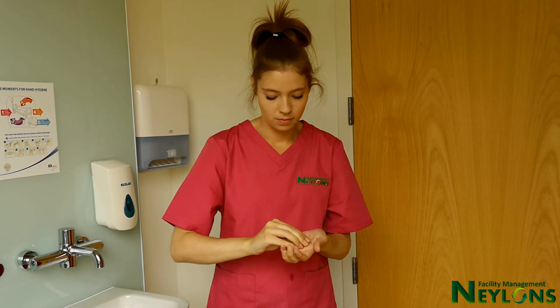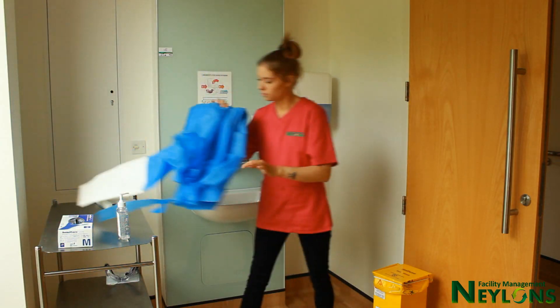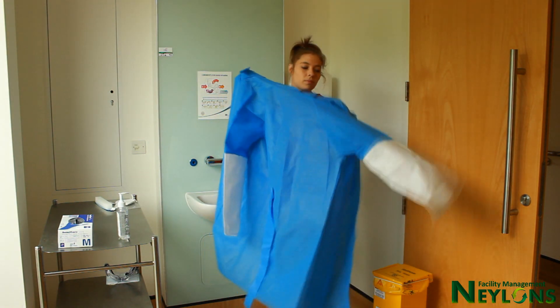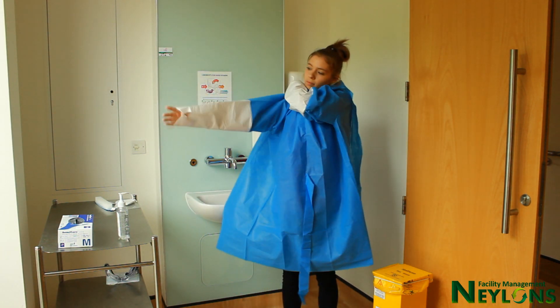Decontaminate hands with a suitable hand sanitizer. Put on your gown, placing thumbs through the thumb holes. Tie at the back or the side. Do not tie to the front, as this is the most exposed area to contamination.